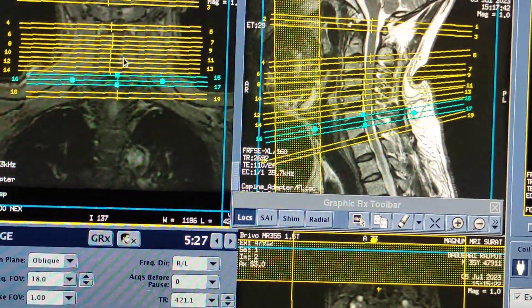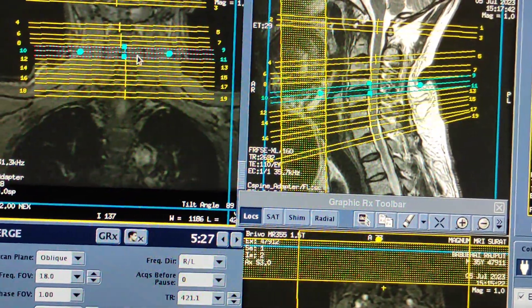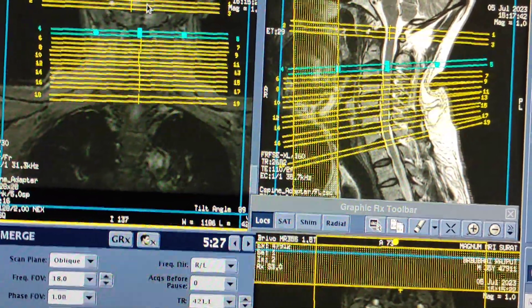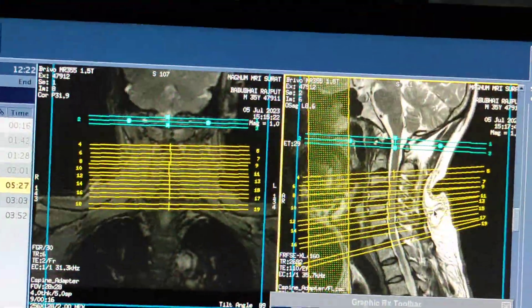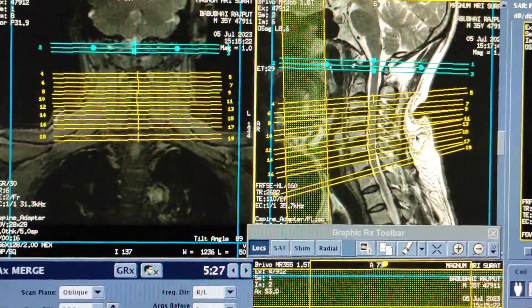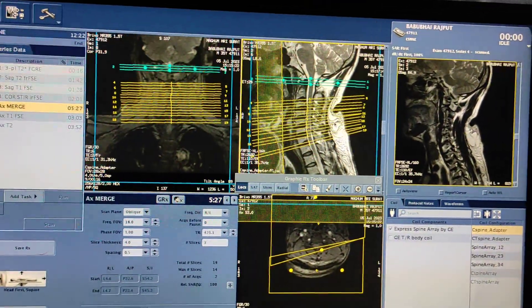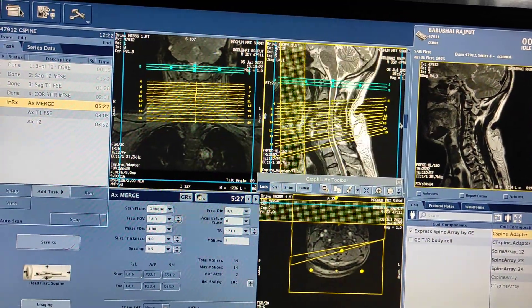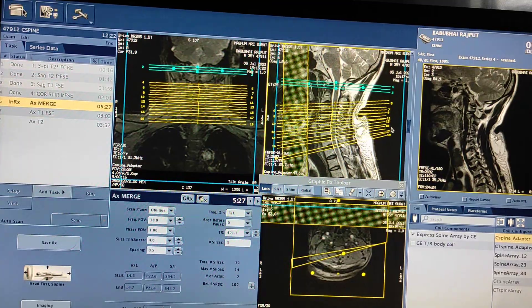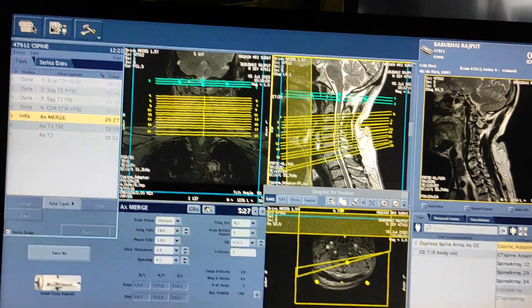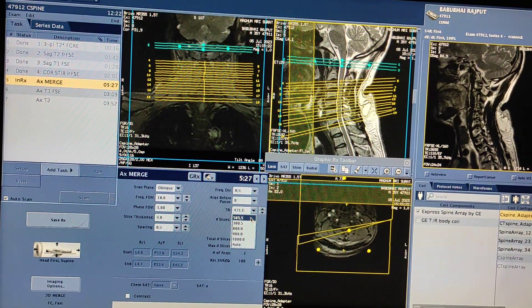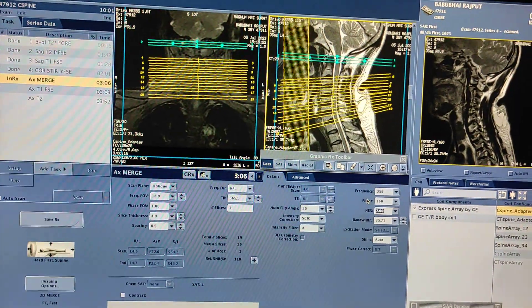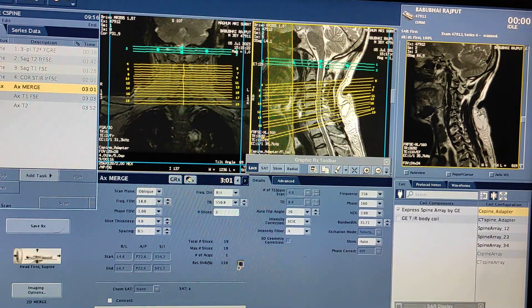Now align this on the coronal. We don't have the option to align in a single shot here, so you have to click single images and align them one by one. This is how you plan for axials. Then again check whether all your slices are covering the region of interest. If not, increase your slices. My first axial plan is now completed.